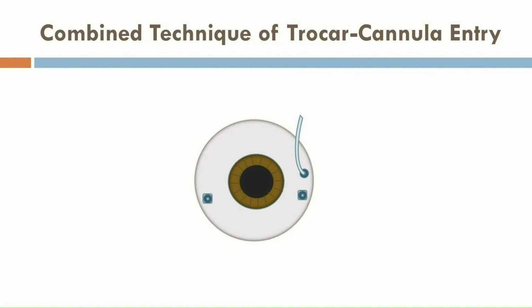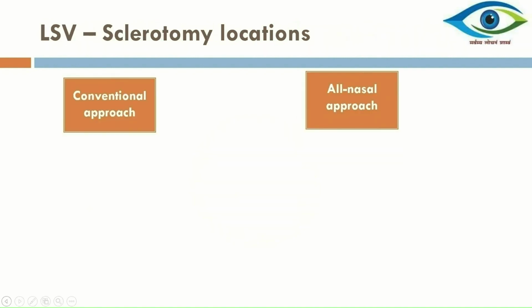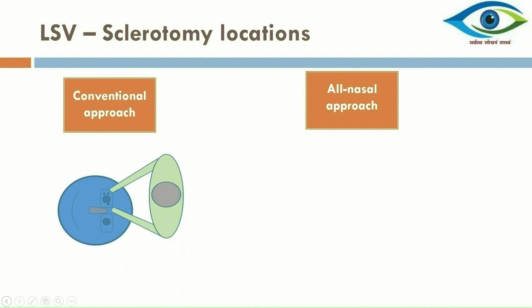remaining two cannulas. The next point we need to consider is the selection of the right quadrants for the placement of ports depending upon the configuration of the anteriorly displaced retina. If the temporal retina is not much anteriorly pulled up, a conventional 3-port approach should be adopted, in which the first port is placed in the inferotemporal quadrant to connect the infusion cannula, while 2 superior ports are used for surgical maneuvers. Here, the surgeon sits toward the head end of the patient.